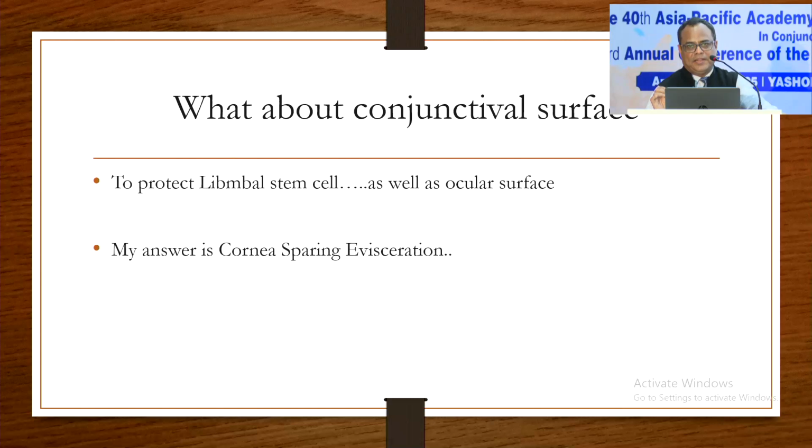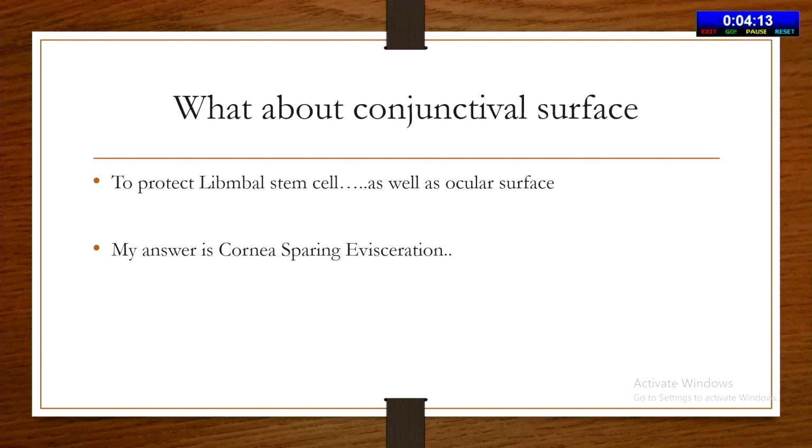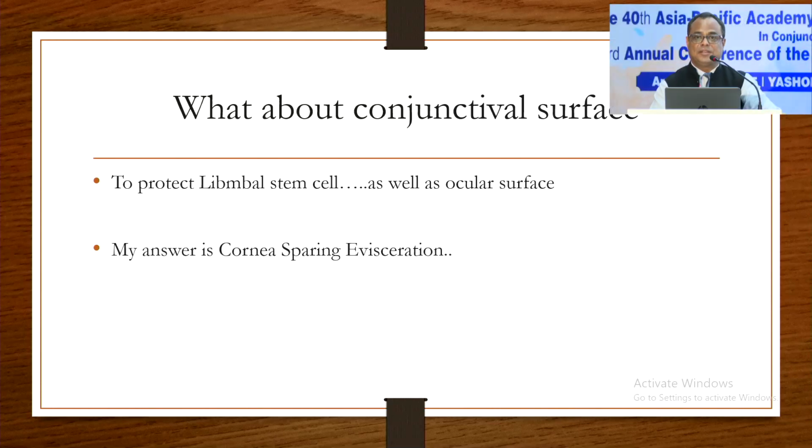Not only the cornea, but the limbal stem cell is preserved, because we are giving the incision, and it is just a disinsert and reinsert like in any squint surgery. Of course, there is some amount of problem with the conjunctiva and tendons, but it is like a squint surgery. It's not like an evisceration proper, because in evisceration and other techniques, we are doing a 360-degree corneal opening or 360-degree limbal stem cell injury. But here we can make the incision from above without touching any limbal system.